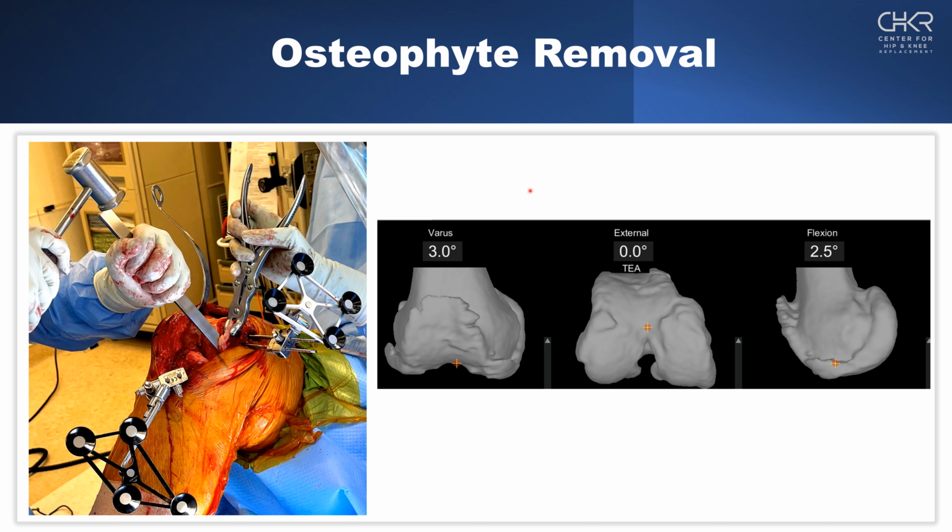All right, the first thing that we always have to do whenever we're dealing with stiffness, once we've characterized the knee, is to understand what is creating tension in the ligaments. And we can see from our three-dimensional formatting, I know exactly where all the osteophytes are ahead of time. So we have a 3D construction in the coronal, the axial, and the sagittal plane. I can see the osteophytes around the trochlea that I saw before and along the medial and lateral condyles. And very clearly, especially when I'm looking at the sagittal view, I can see these large osteophytes that need to be removed anteriorly and posteriorly. So this is the first step that has to happen.